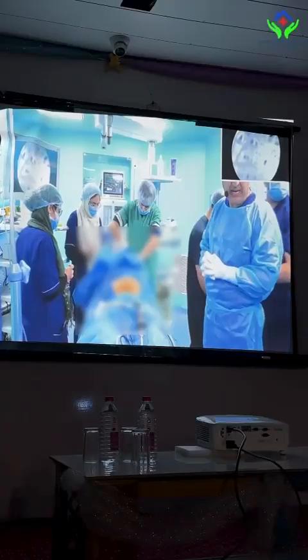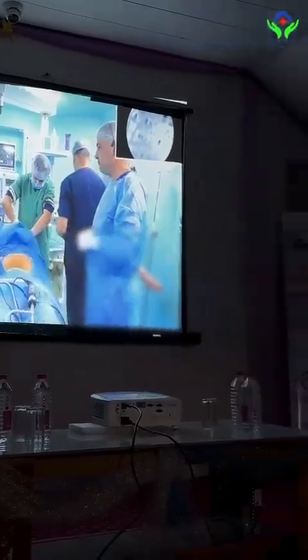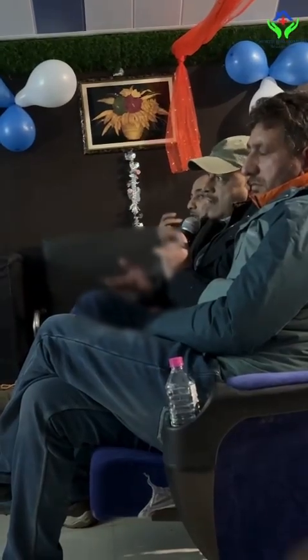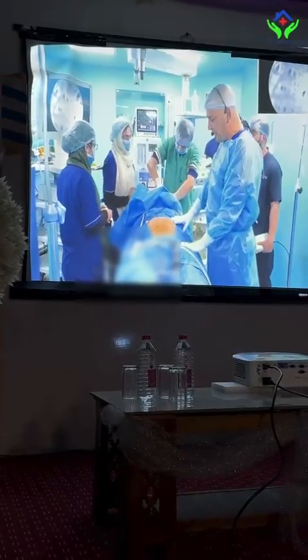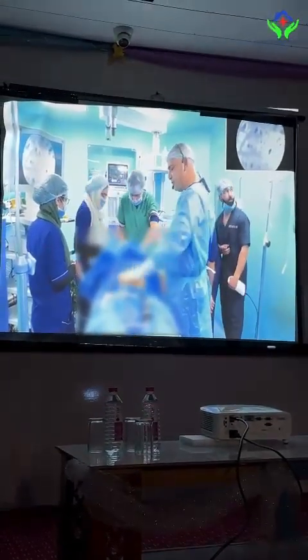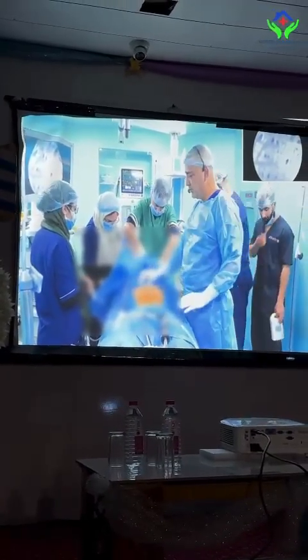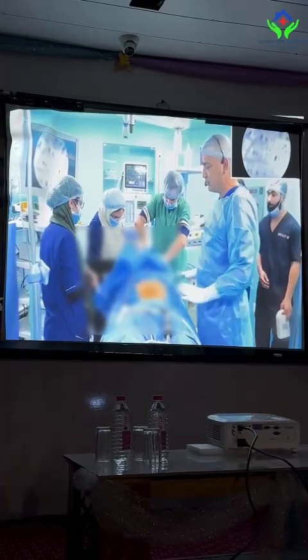Absolutely, yes. So another point I would like to know about in the upper abdomen, right? We should decompress the stomach, and the same holds true for pelvic surgery. Absolutely true. Ask the patient to void or catheterize the patient. Another point I would stress is that in laparoscopy, your exposure of the stomach is also important. Your allied ports should be open. You should be around supraumbilical, and you should have the epigastrium open, because the amount of force would vary.